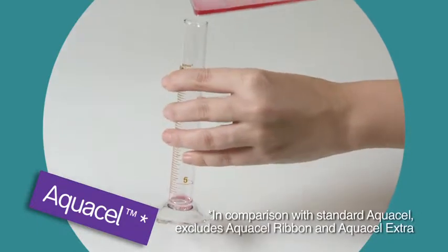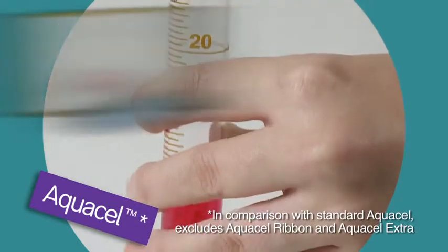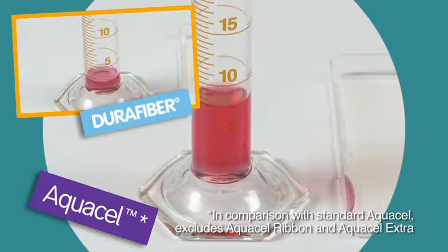This time when the remaining fluid from the petri dish is poured back into the measuring tube, we can see that 8 millilitres of fluid is left with Aquacel, compared to less than 3 with DuraFibre.